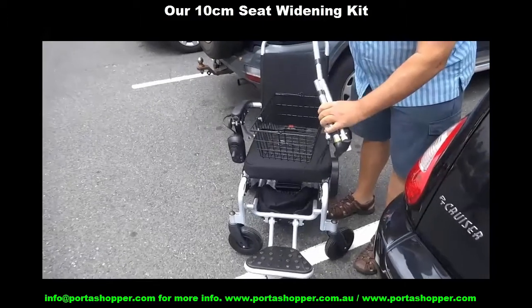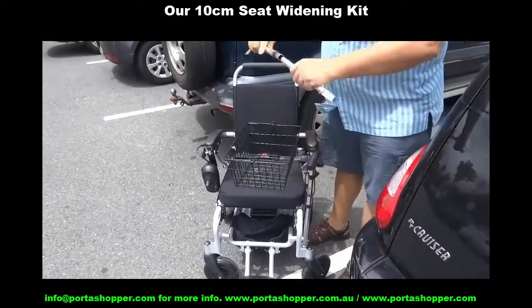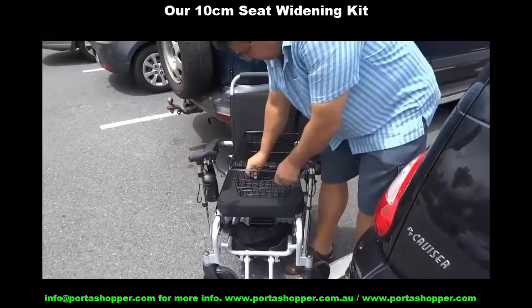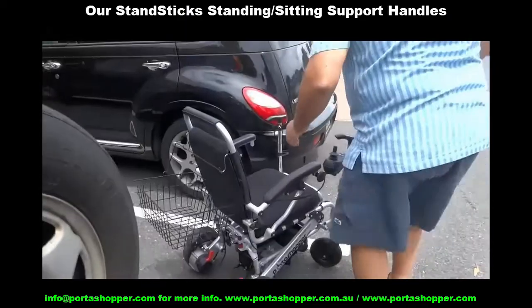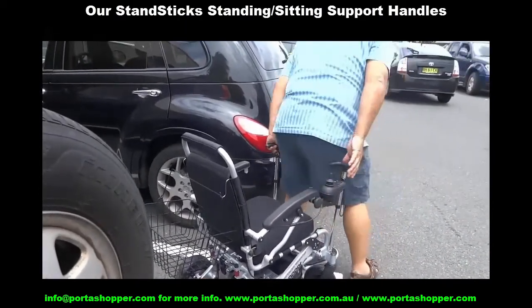If you have balance issues getting into and out of a wheelchair, have you found another model that ships with two adjustable walking sticks with machined aluminium tips that slot into the caster brackets, so you have two sturdy support handles you can grab onto when getting up or sitting down?